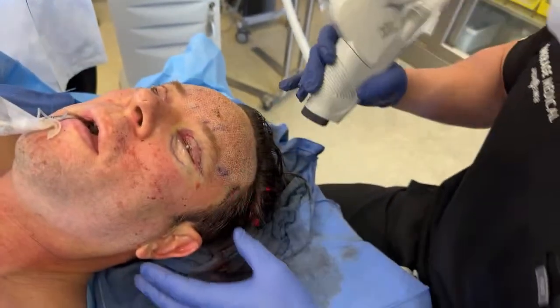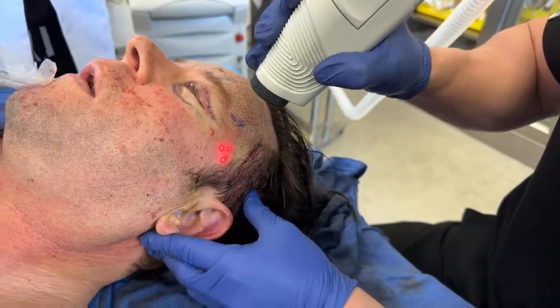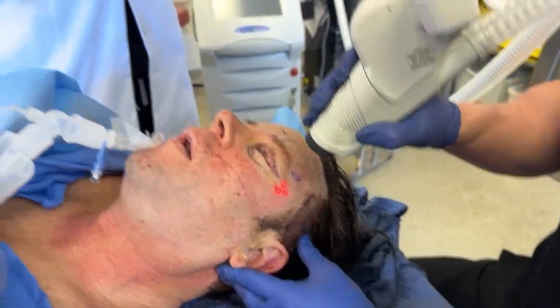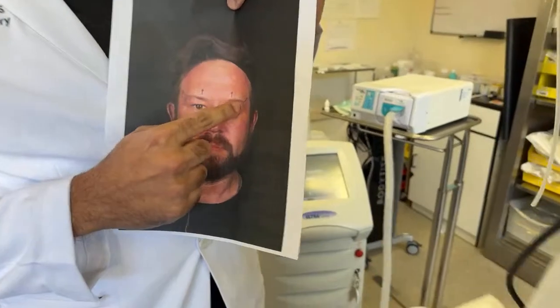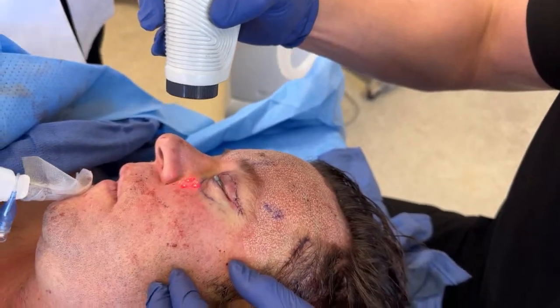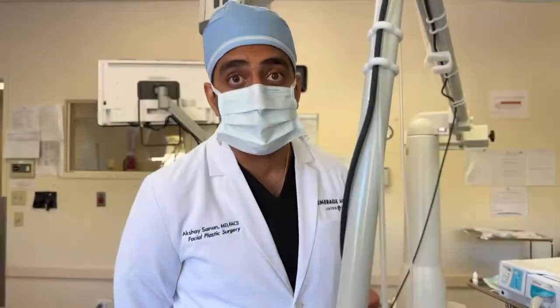Can the laser burn the hair follicles off? No, it can burn the follicle that's there. We actually feather into the hairline, and you guys can see, look, it didn't burn it. So it will not harm the follicle. And then the other things that we did, you can see in the photo, his brows are low, but look, it's got a lot of extra eyelid skin. So we have to lift the brows and then remove some of that extra eyelid skin and treat the under eye fat bags. So this is gonna be really nice upper 1/3 facial rejuvenation surgically, and then full face and neck with the laser.